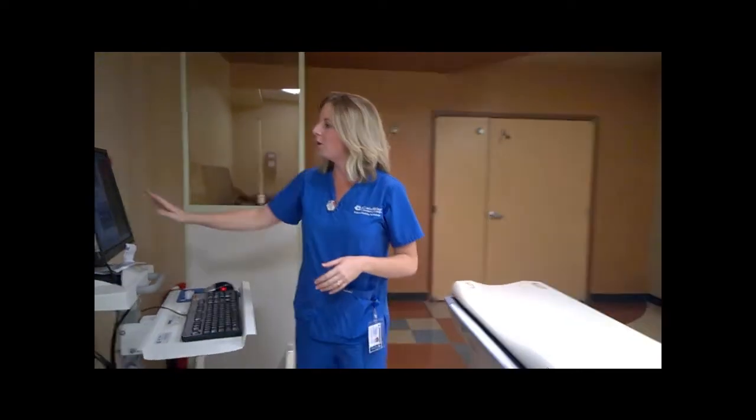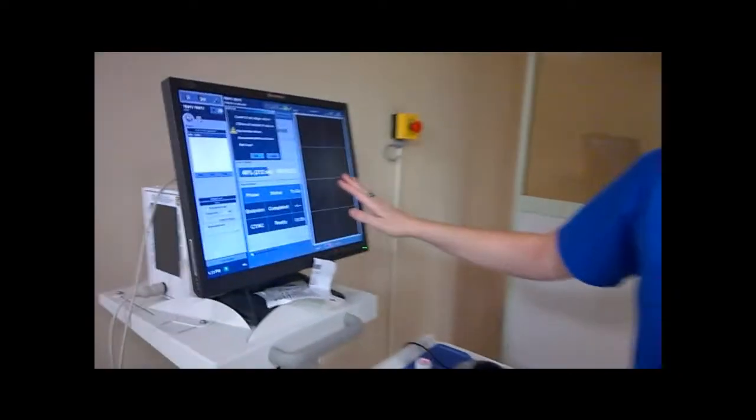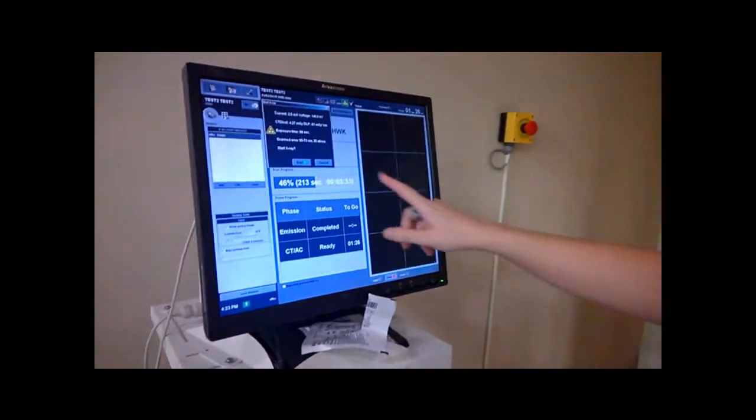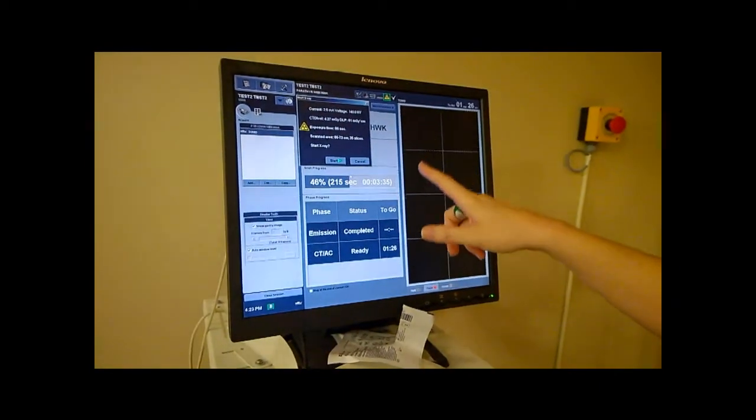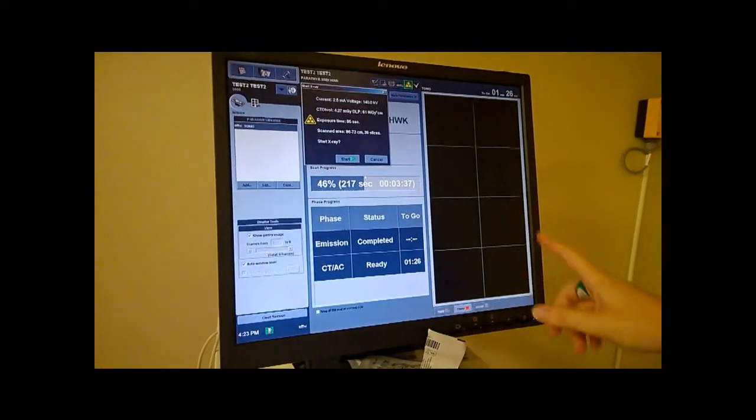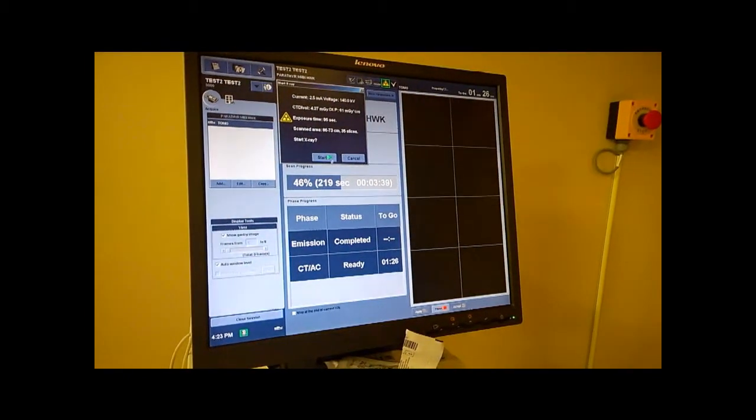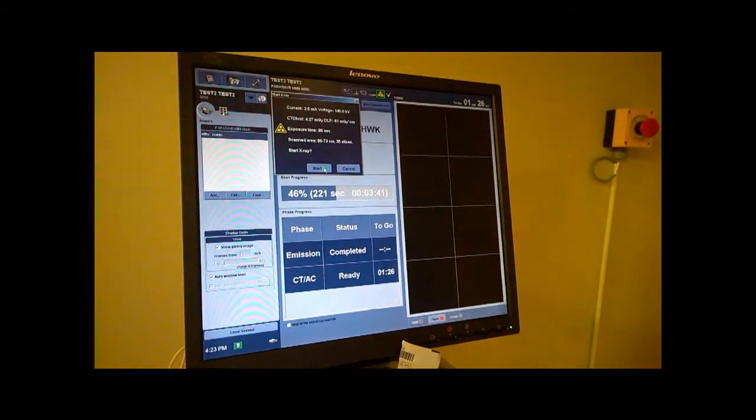At this point, our SPECT acquisition has completed, but the CT is ready to begin. I want to remind my patient what's going to happen and tell them not to move at all in between the two acquisitions. I also want to make sure that if they have their arms up, they have them in very tight so there's no chance of their arms hitting the cameras. Over here on our acquisition station, it's going to ask me to start the CT. I can't start it on the remote — I have to start it right here. As soon as I start that, I'm going to get behind my shield.